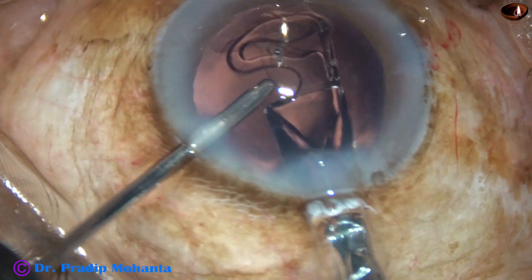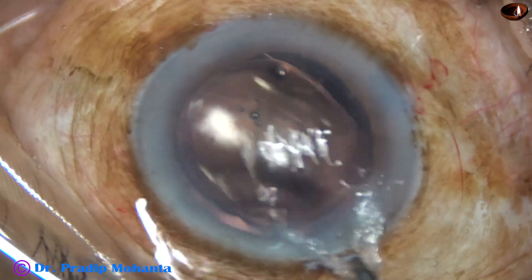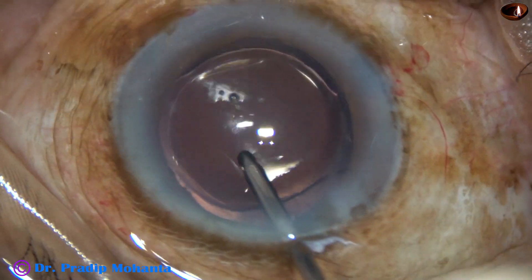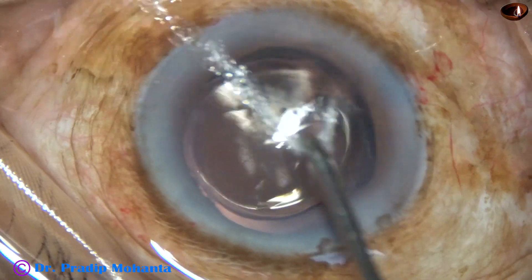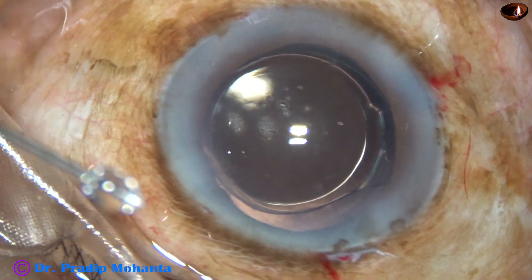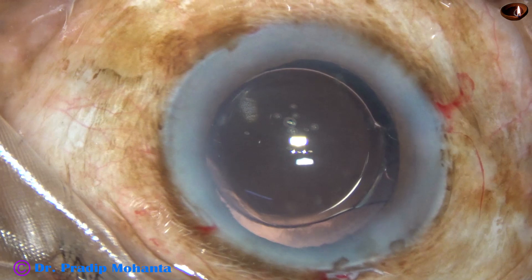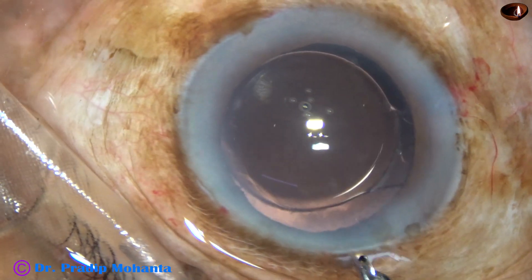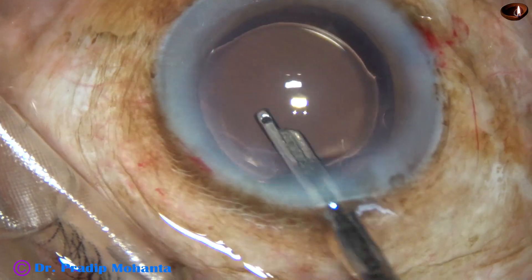And now, this is a monofocal single-piece intraocular lens, and the lens is placed in the capsular bag. This is called hydro implantation — keep the anterior chamber formed by hydro, that is BSS. Since there is no visco in the anterior chamber or the capsular bag, we have saved a lot of time. The side ports are closed — the corneal stroma on either side of the side ports is hydrated and these stab incisions get closed. This is the final lavage of the anterior chamber; whatever visco sticks to the corneal endothelium comes out.